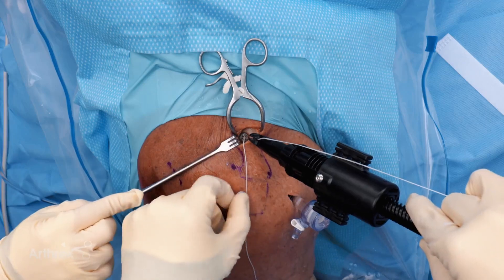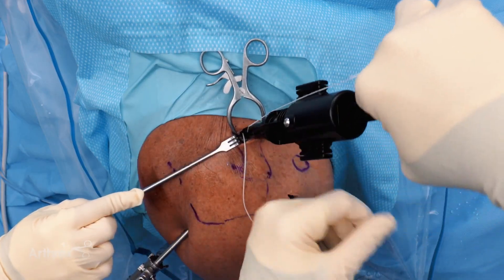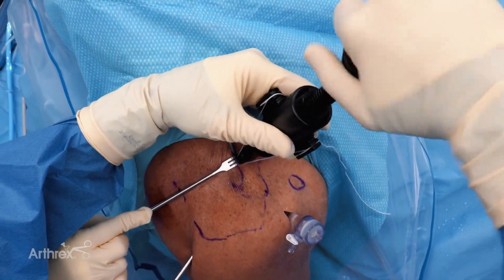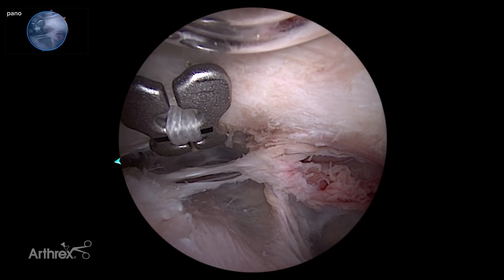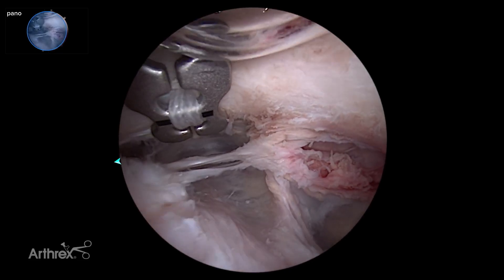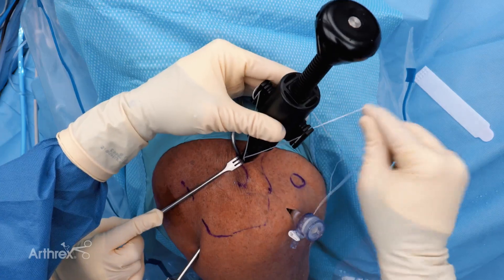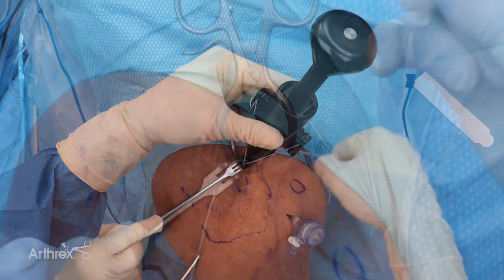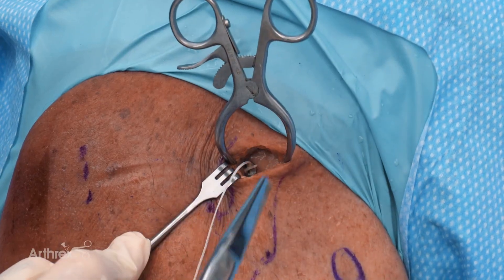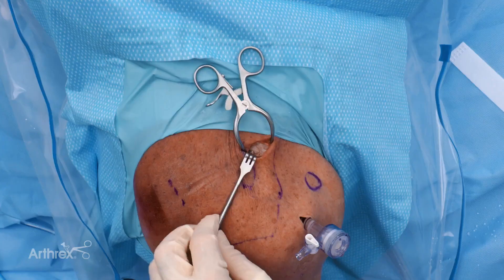Here we have the disposable tensioner from the fiber tape cerclage system. We can use this to help reduce the AC joint — it's a little easier than pulling on the sutures directly. Looking at the arthroscopic view as you do this, you can see the tension sliding through. You have to be careful not to over-secure this because you have a lot of control here. Once you've got the tension set, you can back a little bit of the tension off with the handle, which makes it easier to remove the sutures. Once your construct is set, cut the sutures with a three-millimeter tail — no need to tie any half hitches or back it up. This construct is biomechanically sound, and that's our technique.